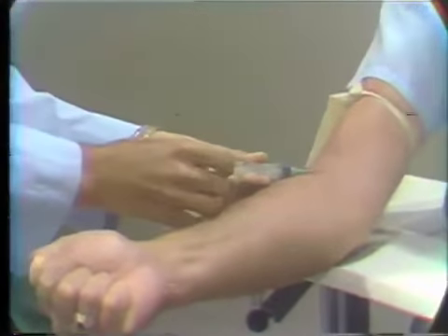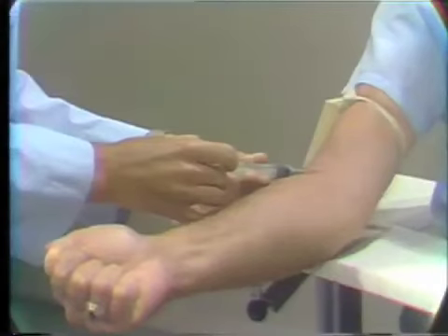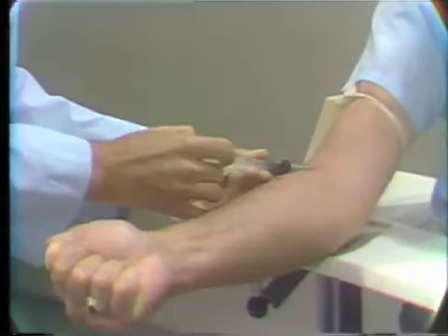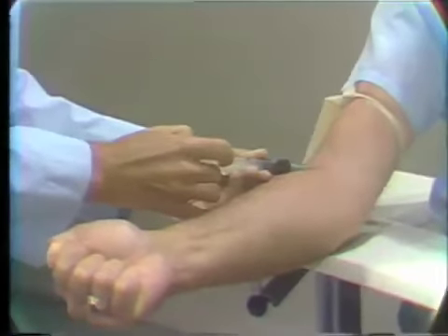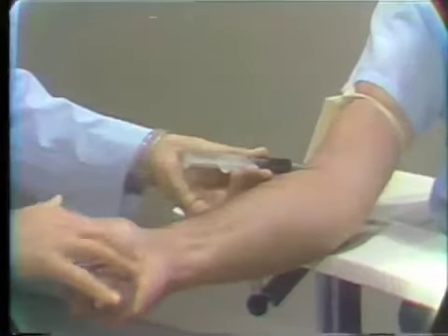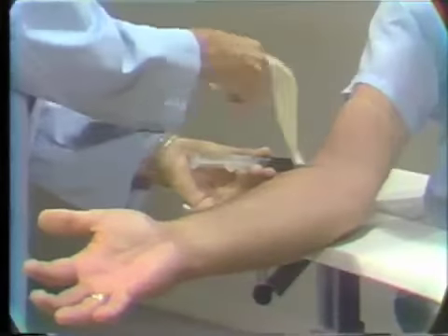Now I will draw the blood into the syringe, and here I'll be wanting probably about 6 to 8 cc's. Okay, after I have obtained the amount of blood I want, I'll have the patient release his fist. I will then one hand release the tourniquet, getting that out of the way.